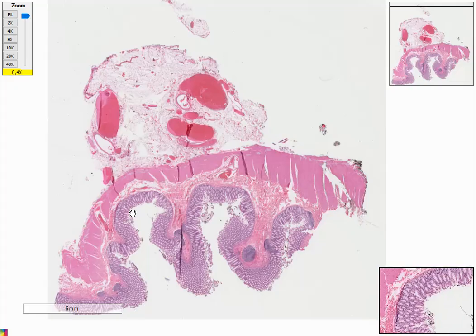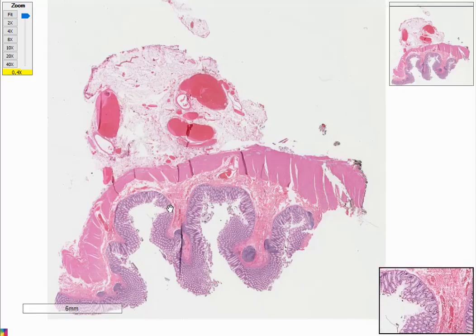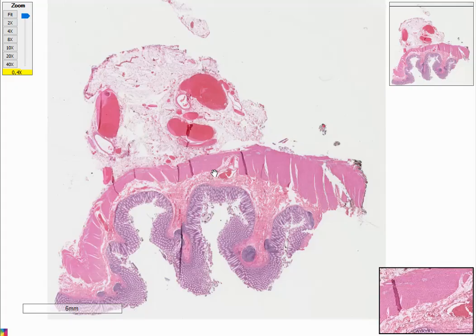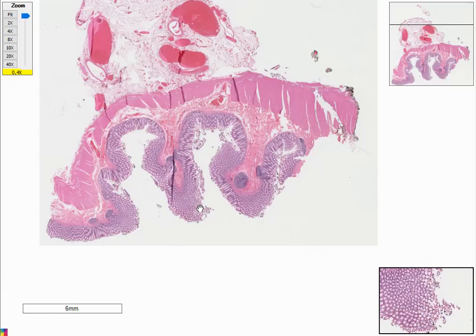Remember that in the intestines, which includes the large bowel, there is a mucosa, muscularis mucosa, submucosa, and muscularis propria. And then this here, which you're seeing, is probably a piece of mesentery which attaches to the large bowel. You can even see there are blood vessels there. Anyway, let's have a look at the mucosa.